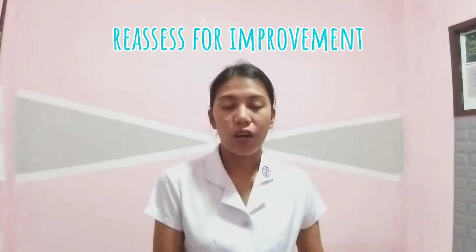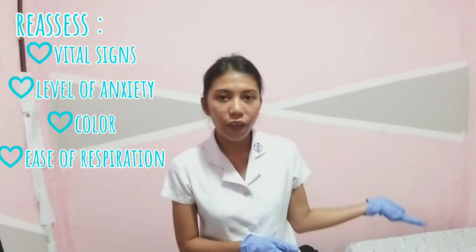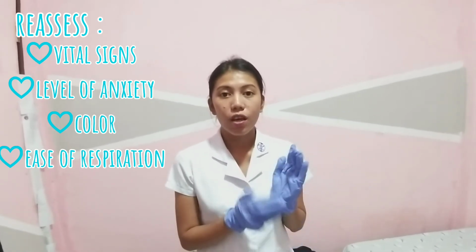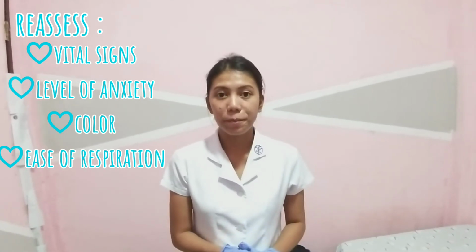So after everything that we have done, we should never forget to reassess the patient after the interventions. So we can assess the patient through her vital signs, level of anxiety, color, ease of respiration, and provide support while the client adjusts to the device.